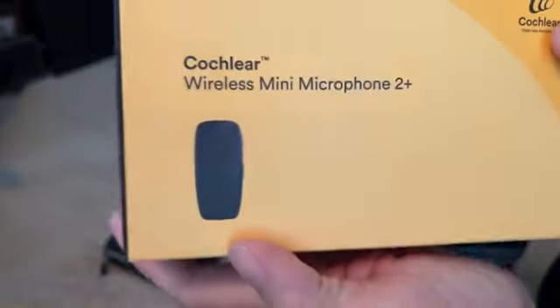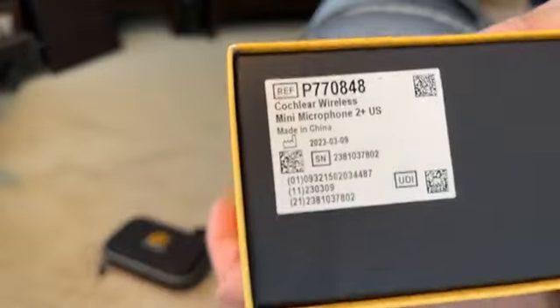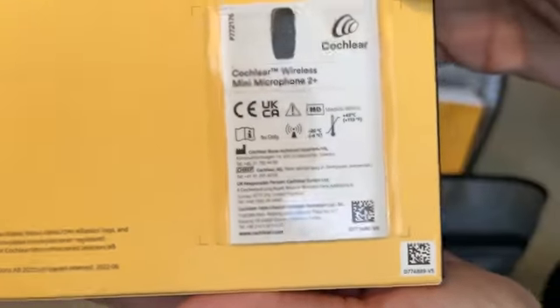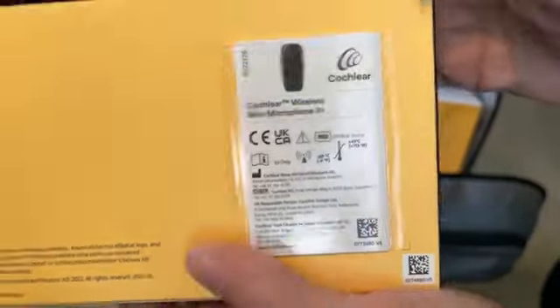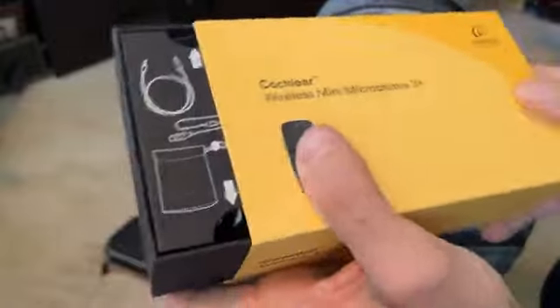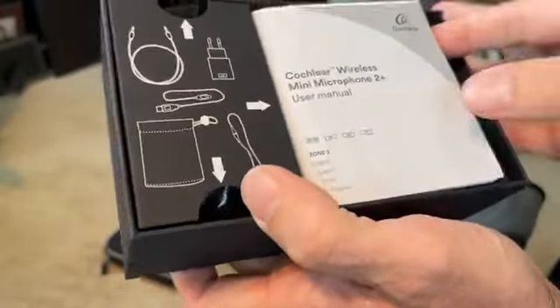One of my options was the mini microphone. In case you were curious about it, you can look it up — there's the info and ID for it. I'll make a more detailed video of the unboxing and activating and using it.